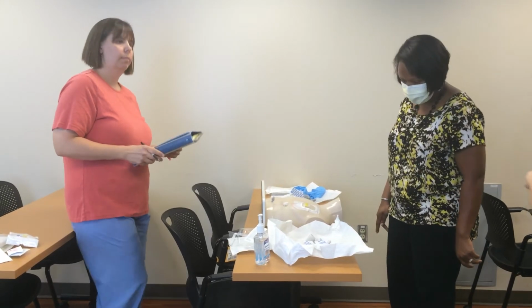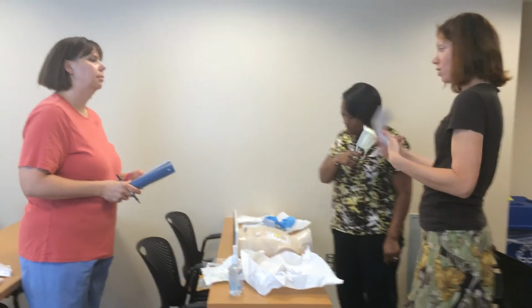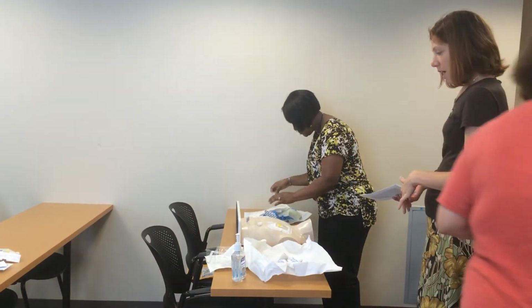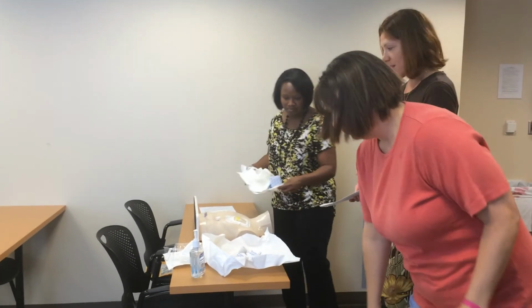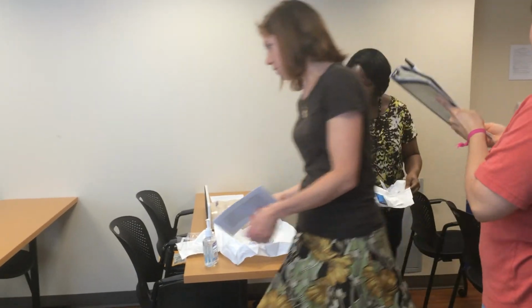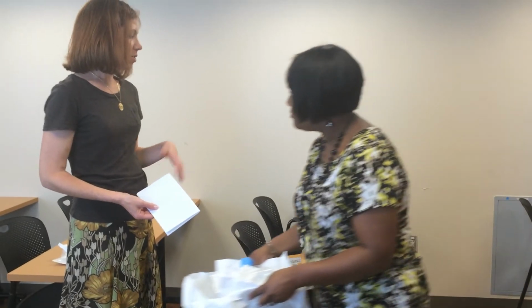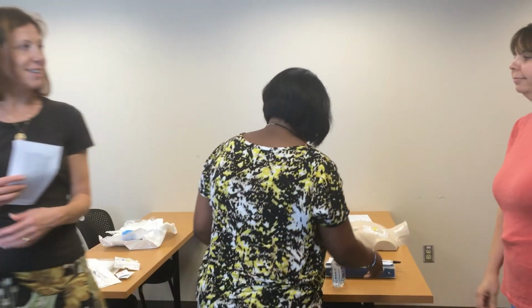That's great, thank you, Ashley. So at this point, if you want to get your mask off, we'll have you guys switch spots. Susie will take a turn. She can actually act as though the patient is already accessed and remove his dressing and then do a re-access on that, once a week schedule. I'll move out of your way. And then we'll talk a little bit about what Susie observed for Ashley, what Ashley observed for Susie, and what you've learned from doing this process.